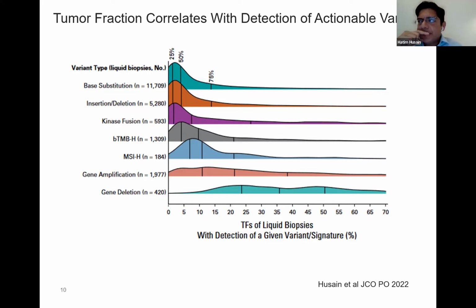So the tumor fraction is an estimation of both somatic mutations, but also copy number gains and losses, or just structural changes. And I think even if the cancer has a limited number of mutations compared to wild type DNA, even with a limited number of genes, let's just say EGFR, it still has a lot of structural changes.